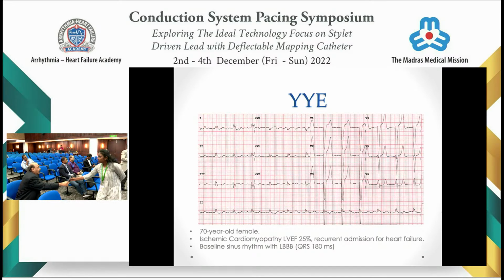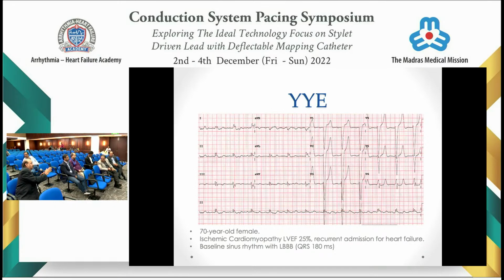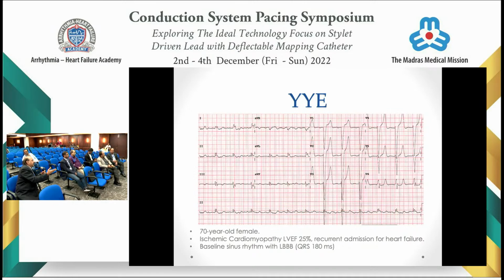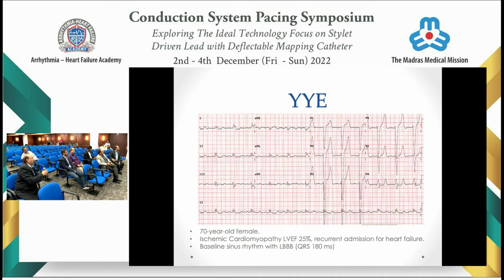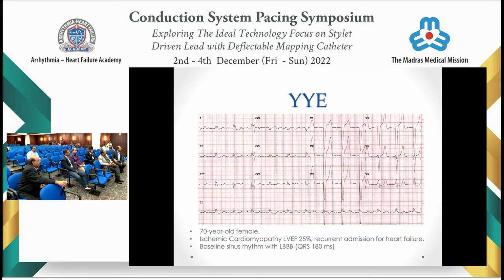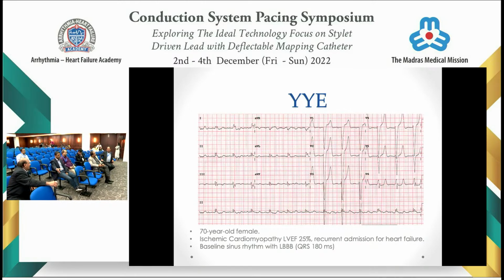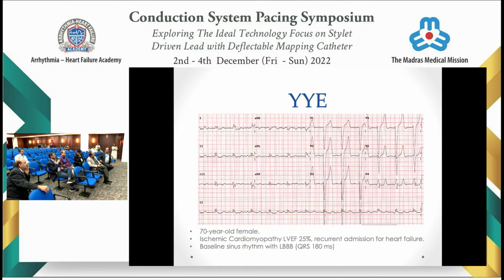So that you can correct the intrinsic conduction through the left bundle and right bundle, you pace earlier so that you can correct it and it becomes narrow. And vice versa. I will show you the vice versa here in a little while, in our patients with left bundle branch block, where there's also right bundle conduction delay, and how I use the AV nodal conduction to come down to help us correct that.